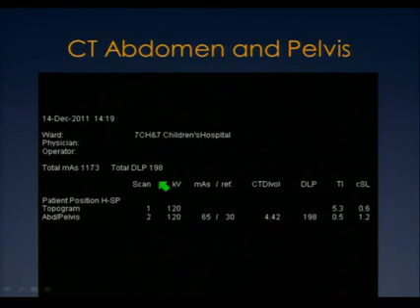But to do that, now I learned something. Is Keith here? I learned something this morning from Keith Strauss, and that is that everything I thought I knew about dose length product is probably incorrect. So there you go. So I'm going to say that I'm using this metric, Keith, just so I can compare things. But as Keith taught me, this is not individual patient dose.